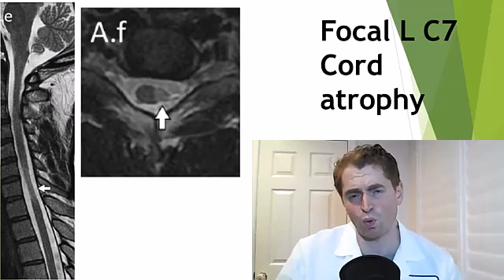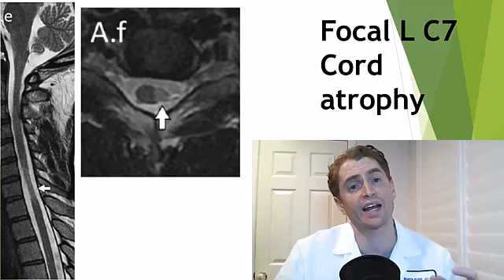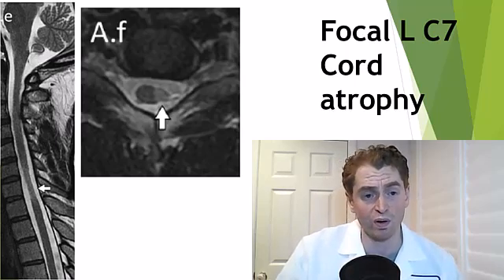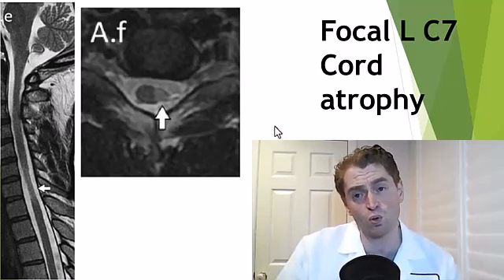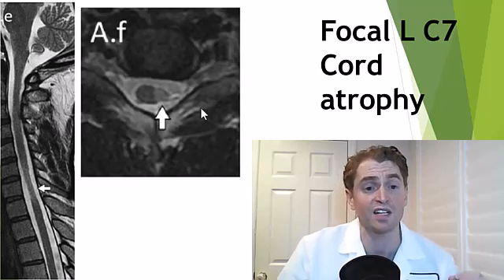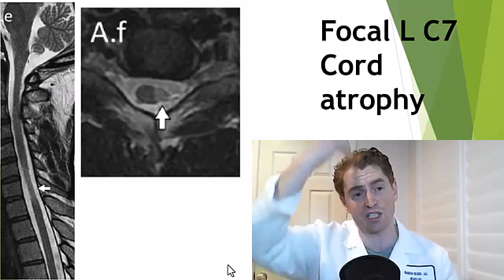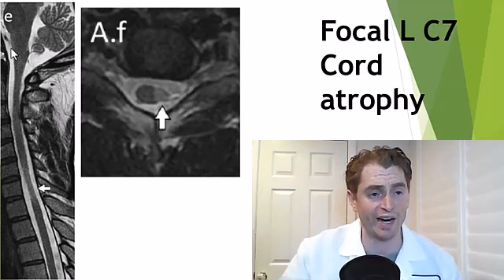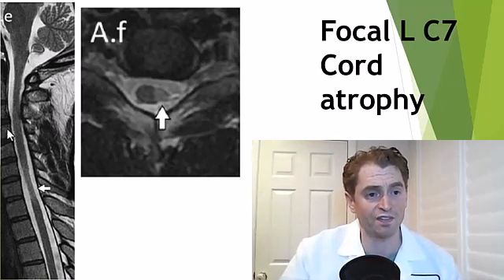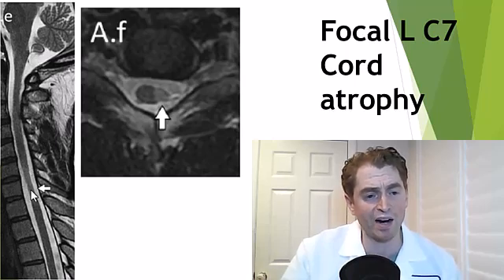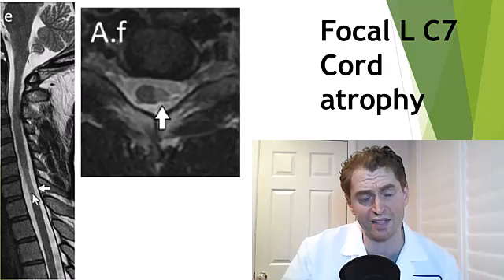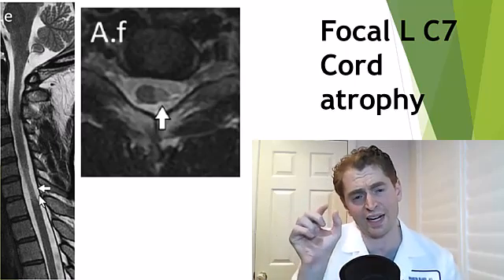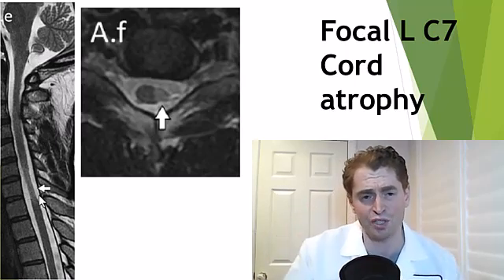Next, we'll look at spinal cord atrophy. Just like you can have atrophy or shrinkage of the brain, it can also occur in the spinal cord. This is an example of focal C7 left spinal cord atrophy. On the left, we're looking at sagittal images. Here you can see the brain stem, and vertebral levels C2 through C7. The spinal cord not only has a T2 bright lesion — it's also shrunken in caliber, indicating some tissue damage.